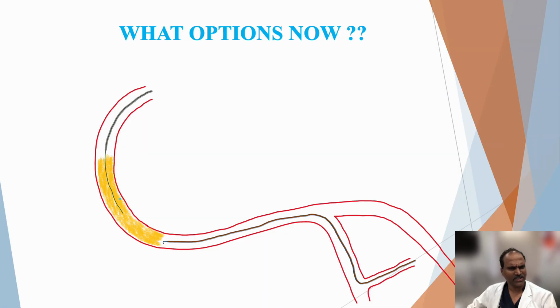So connecting spaces is a very important thing in a retrograde intervention. Once you are there with retrograde, either you continue with your wire proximally, or you can bring your antegrade wire into the true lumen using this as a marker wire. These are the only methods.